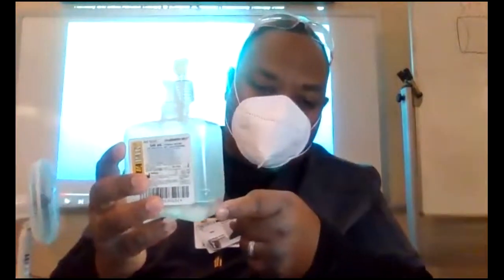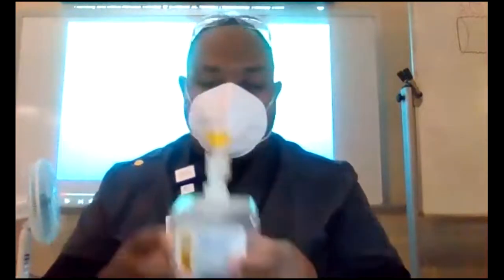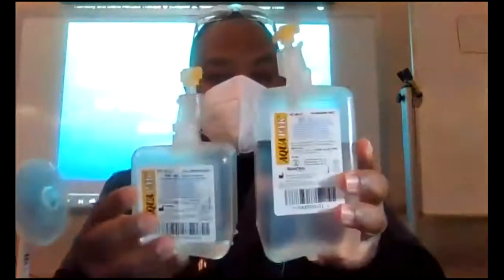So as the bubbles go up through the water, and it's kind of empty, it's usually full, but as the bubbles go up through the water, they pick up moisture, okay? The more time of contact, just like your nose, the more time the air has to contact with the inside of your nose, the more humid it'll be when it gets to your lungs. Same thing here, time of contact. We're trying to make the bubble touch the water as long as possible before the gas comes out to the patient. This is a bubble humidifier, also known as a bubble diffuser. Sometimes they call it a bubble diffuser. Now this is a smaller one. Now, this is also a bubble diffuser, but look at the difference.